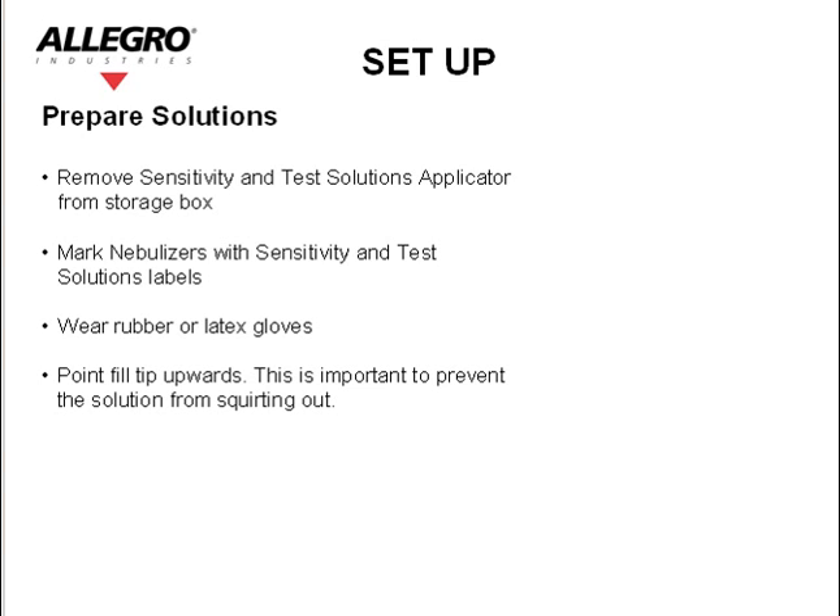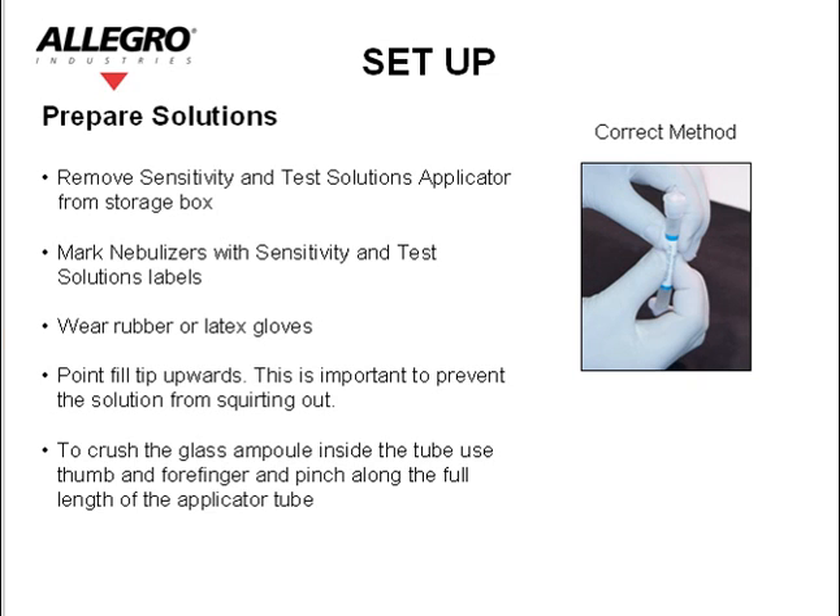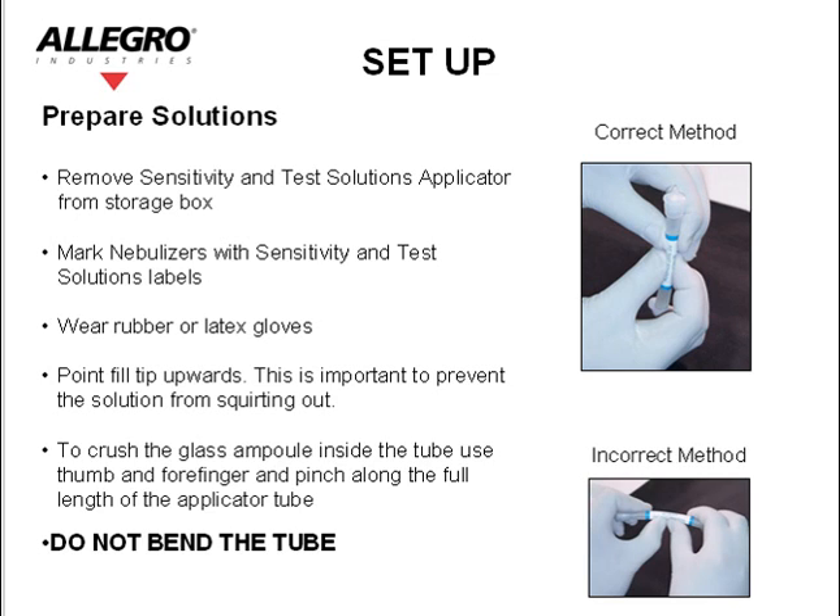Prepare solutions. Remove the sensitivity and the test solution applicators from the storage box. Mark the nebulizers with the sensitivity and test solution labels. Wear rubber or latex gloves. Point the fill tip upwards — this is important to prevent the solution from squirting out. To crush the glass ampoule inside the tube, use your thumb and forefinger and pinch along the full length of the applicator tube. Do not bend the tube.